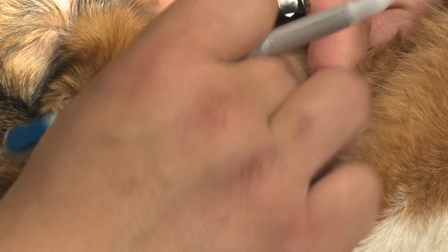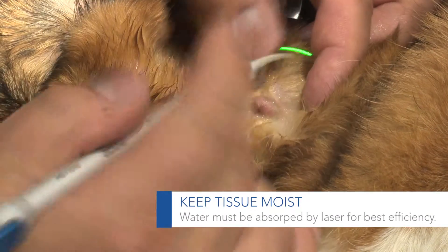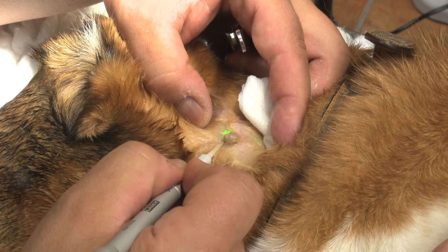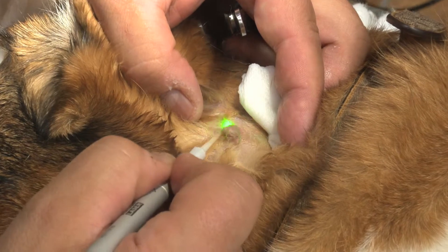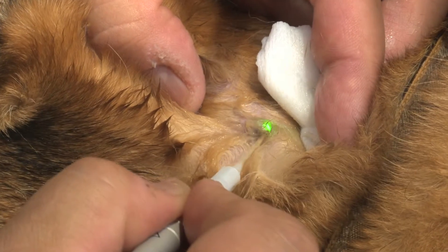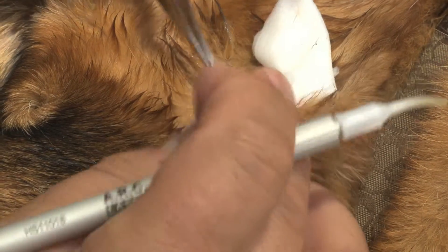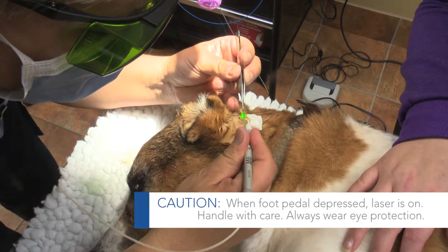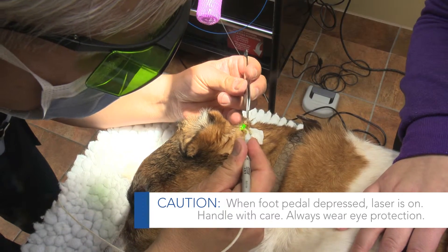I've moistened the area, and we're going to go ahead and laser resect. We're actually shaving this off of the skin, which is really nice with a laser — it's almost like you've got a scalpel that you're using, and I'm just going to shave it off. As it's shaving, we're also cauterizing and minimizing any bleeding associated with it.